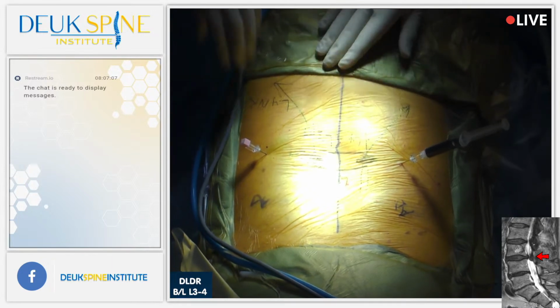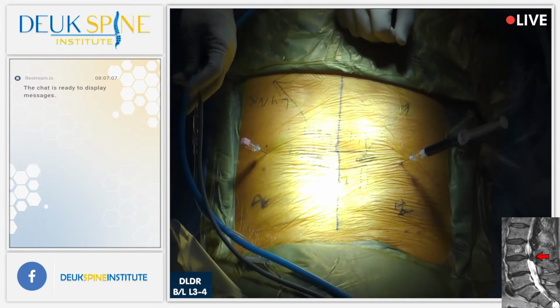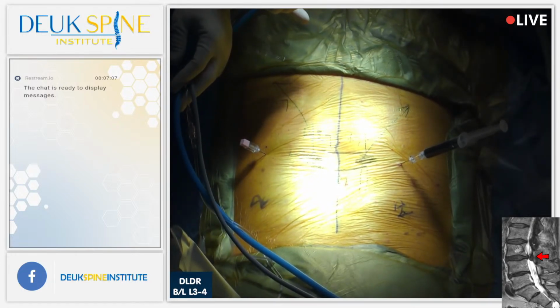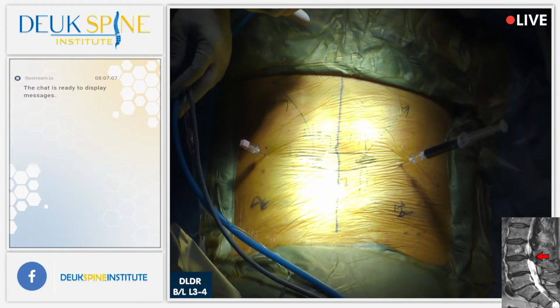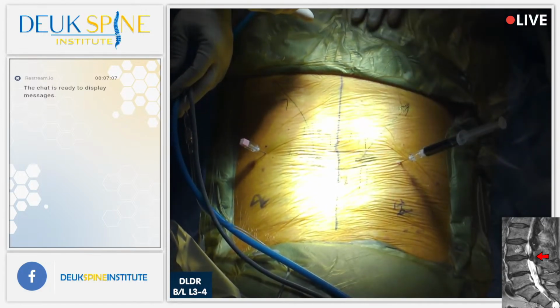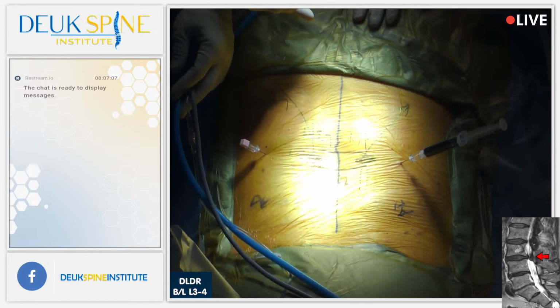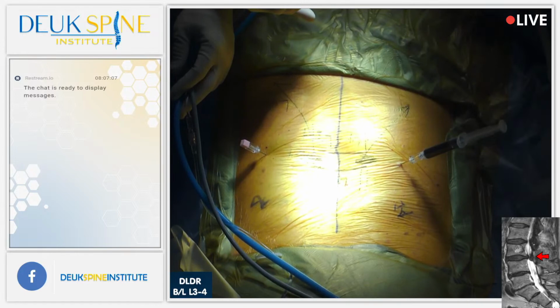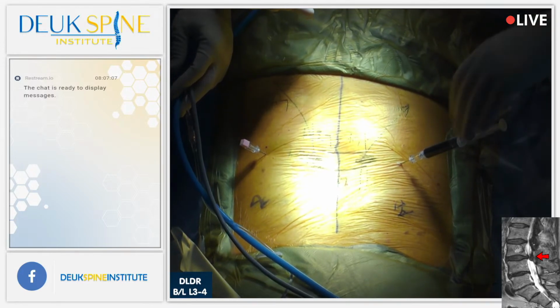You comfy? You doing okay, sir? Yes. All right. Are you having any pain? Any pain in your legs? Anywhere. Yeah. Now he's responding, he's reliable, and we also need him reliable to do the discogram, because we're going to want to know, is this a painful disc? Because that's, after all, one of the reasons we're here operating.